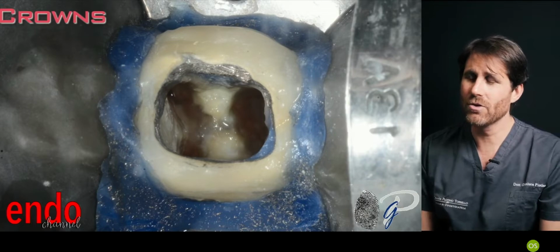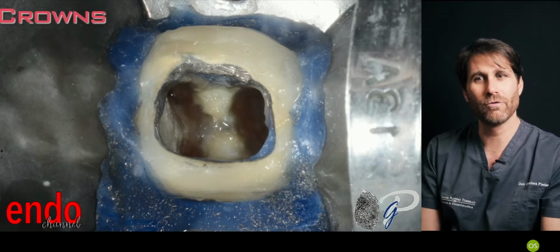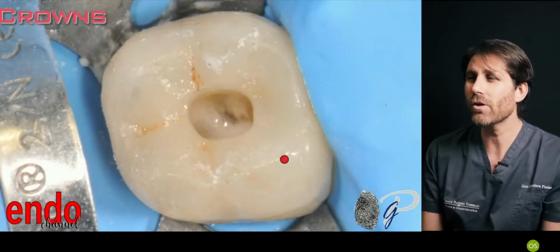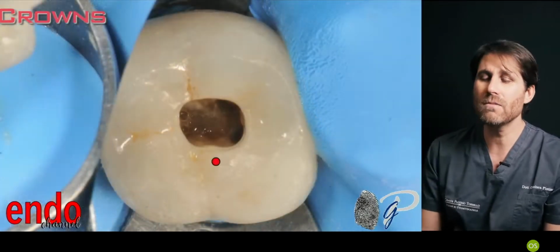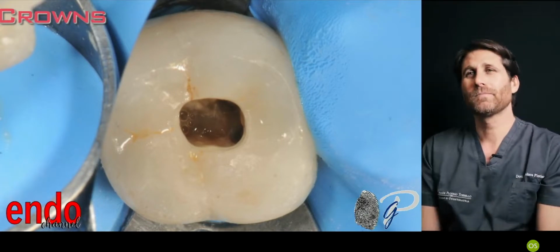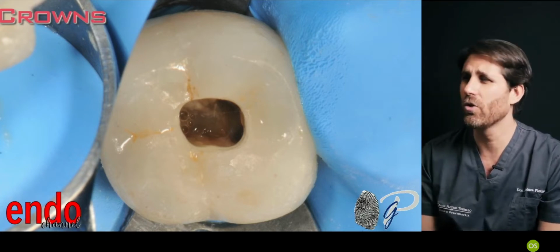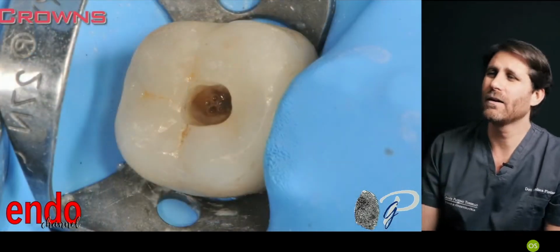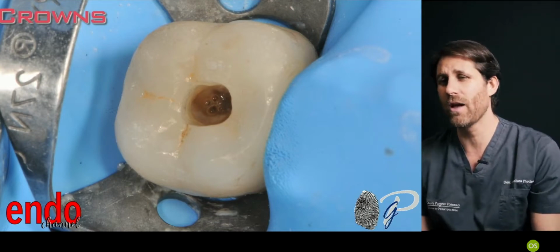We will replace it, so this has been done only because they need to pass through the crown because of the treatment. This is a new zirconia crown. In this case, the access was more conservative in this lower molar, trying to maintain a little bit more of the crown, even if the crown is replaceable with another material, a composite restoration. So trying to reduce the amount of dentin removed and the amount of crown removed in these crowns that we have to maintain.